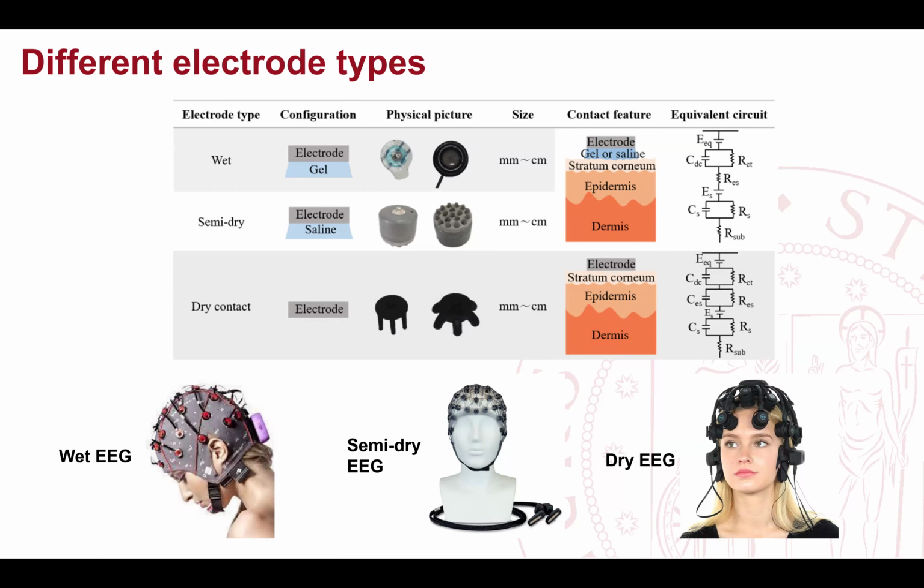g.tec now came out with a very interesting technology that tries to emulate, and I would actually like to try it once on the data. And now I explain why, because they are really trying to replicate almost the same signal quality that they have with invasive recordings using non-invasive EEG, which is the Pangolin.